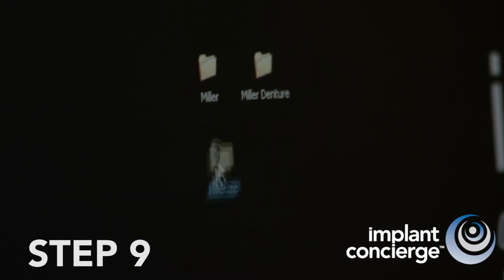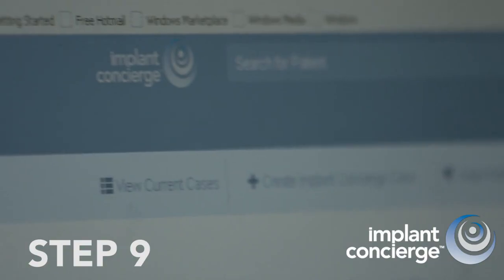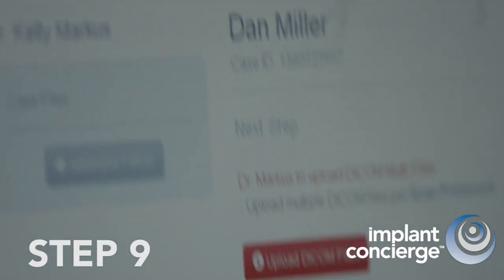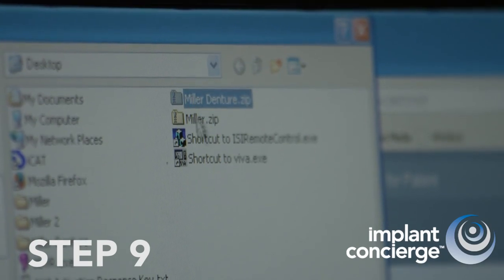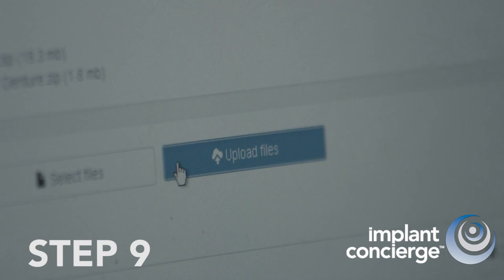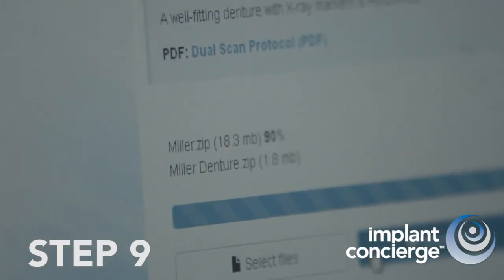Step 9. Once both DICOM folders are compressed, proceed to your patient's profile page on Implant Concierge. Then, press the red action button, Upload DICOM Files. Be sure to select both compressed folders and then hit the Upload button. Follow the on-screen prompts and ensure that both files were uploaded successfully to Implant Concierge.